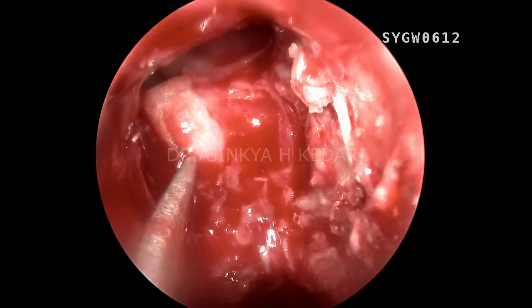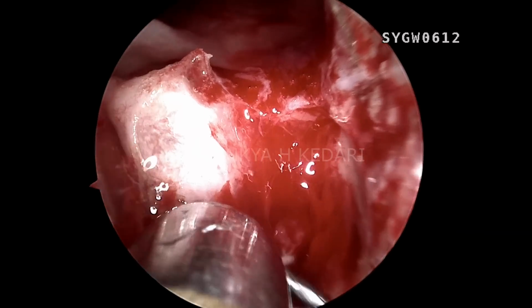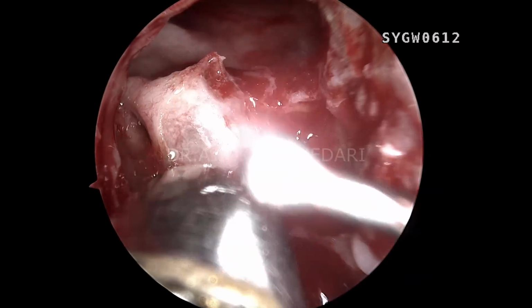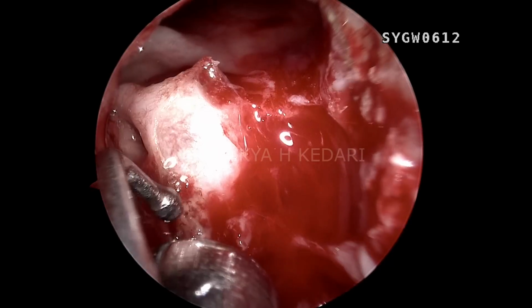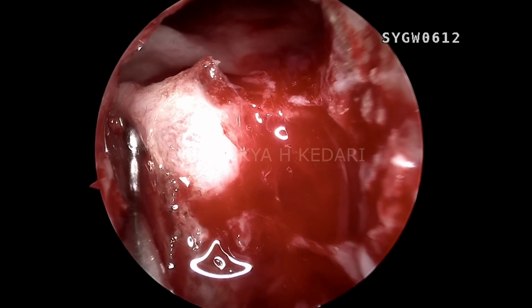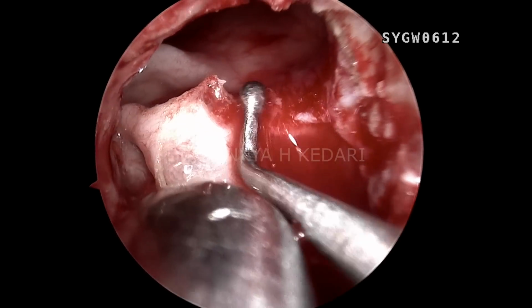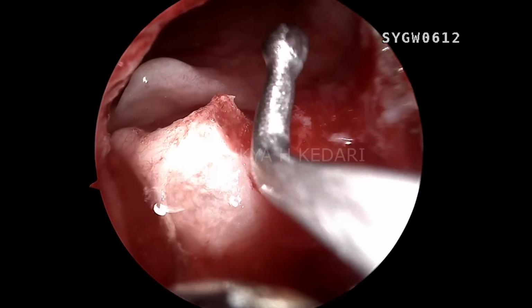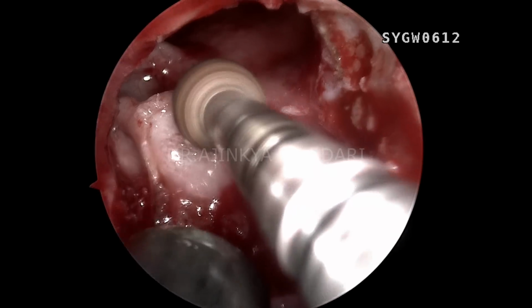That's the cribriform behind down there with the first olfactory neuron. Now you can see that's a good exposure on all sides. I've started doing the four-handed technique right now. Up until now I was doing a two-handed technique along with my assistant, but now I have shifted to a four-handed binostril technique for the approach. So you can see that's a huge opening up there.